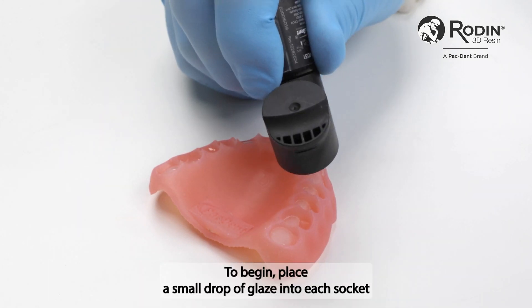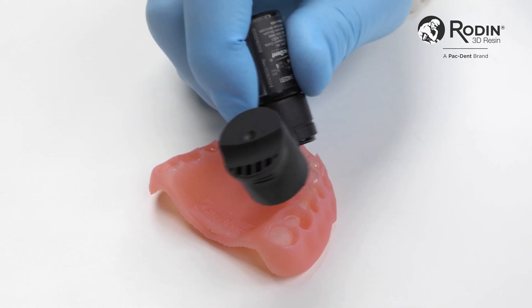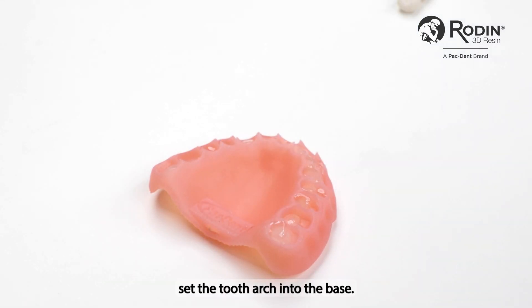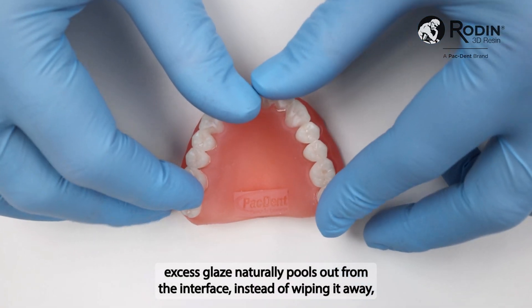To begin, place a small drop of glaze into each socket of the denture base. Once completed, seat the tooth arch into the base. As the components come together, excess glaze naturally pools out from the interface.